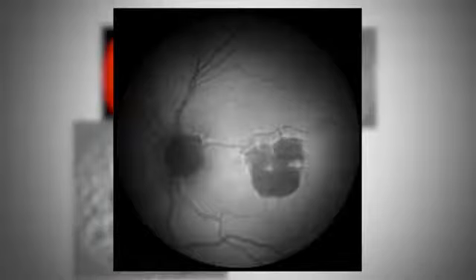Now, once we captured this particular image, it was really interesting because she was telling me, well, you know, in the center part of my vision, I can see a little bit, and I doubted that. And once I captured the image in autofluorescence, right in the center of her macula, you can see a small white reflection there. Well, that actually is tissue that's still alive that I could not pick up in the CSLO. It was completely black. I missed it totally.